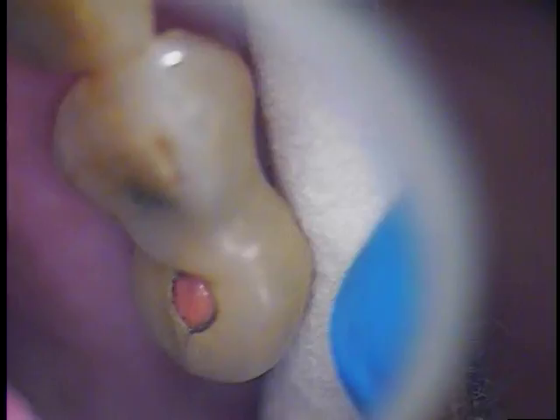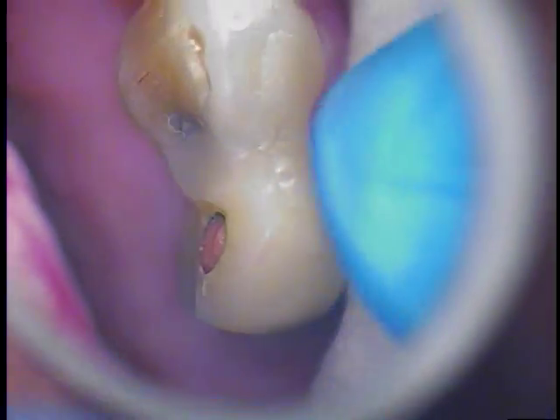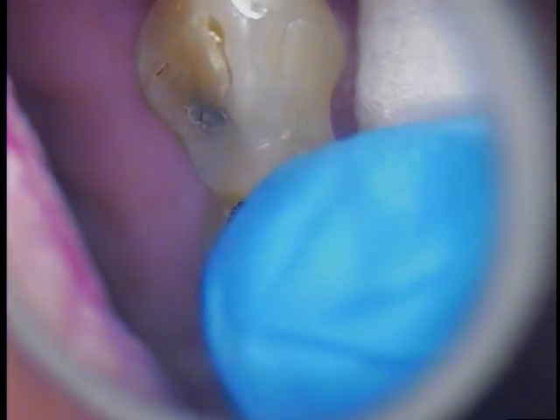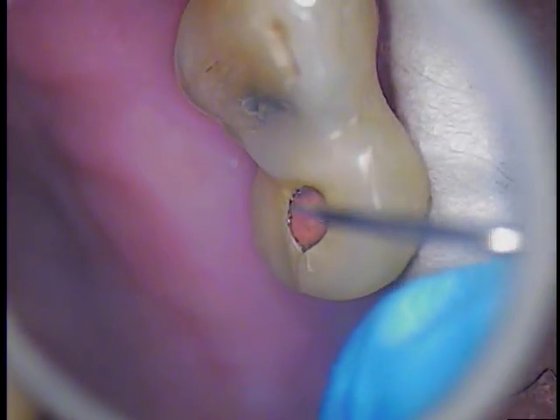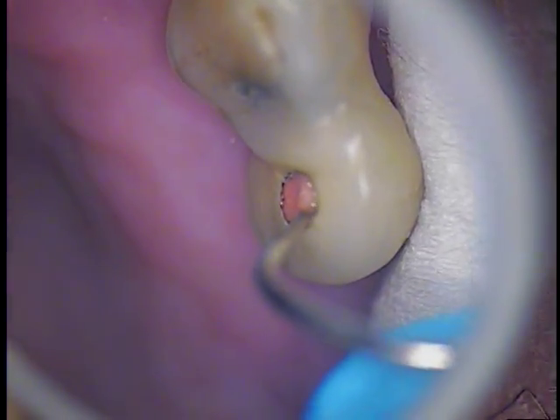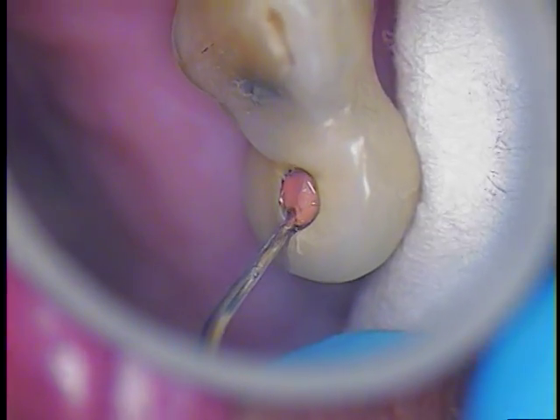It had a couple of attempts toward this case already. Today we're going to uncover what we accomplished last time. Let me go over the case a little bit. First of all, this is tooth number 5 — it's in the implant position number 5. There's some bonding that we applied to it to secure the tooth; that's step 1 in my protocol. Step 2, we were basically waiting on a screw. Finally, after the weather cleared, FedEx was able to deliver it, but it came a day late.